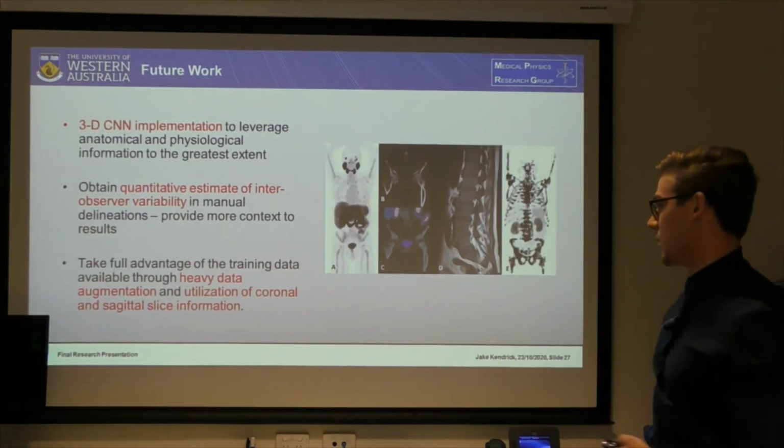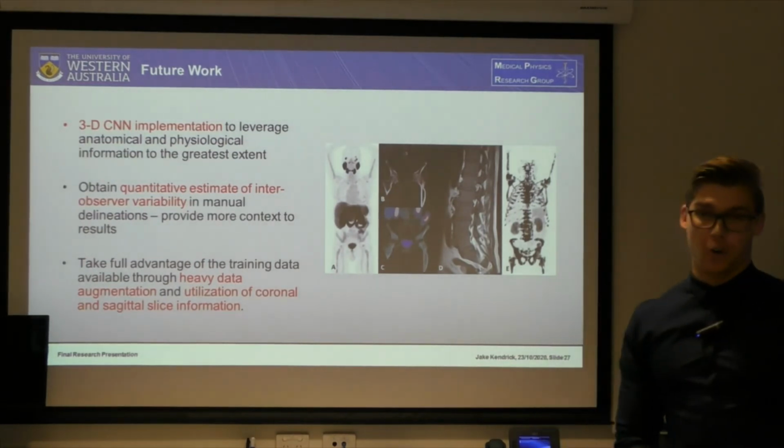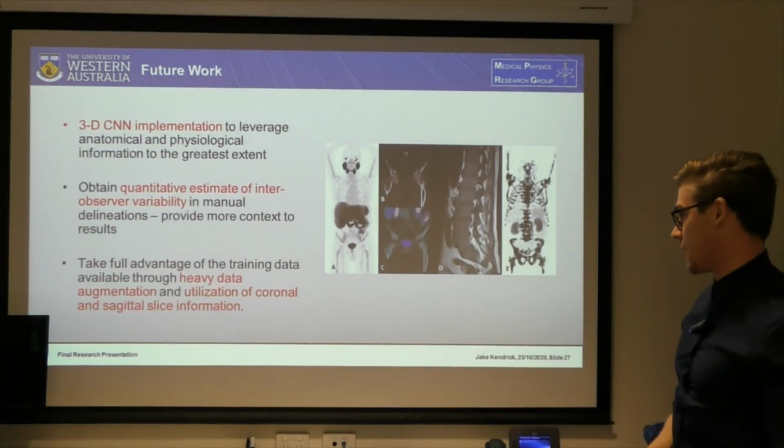Also, we might want to take full advantage of the training data through data augmentation techniques and utilization of coronal and sagittal slice information.